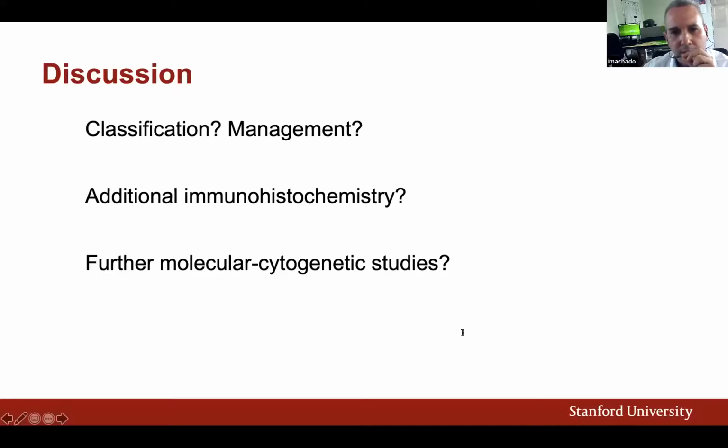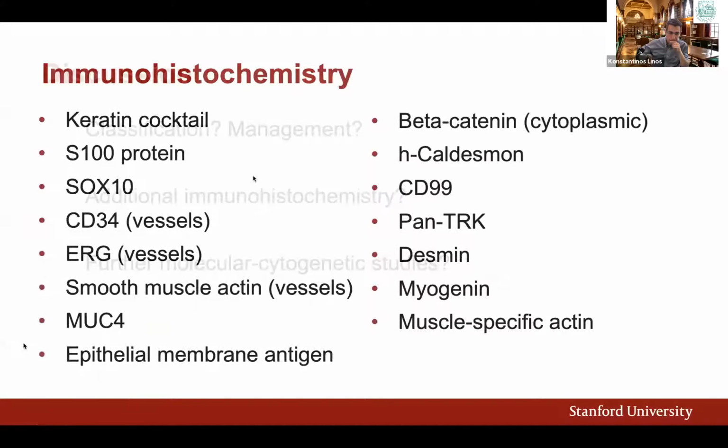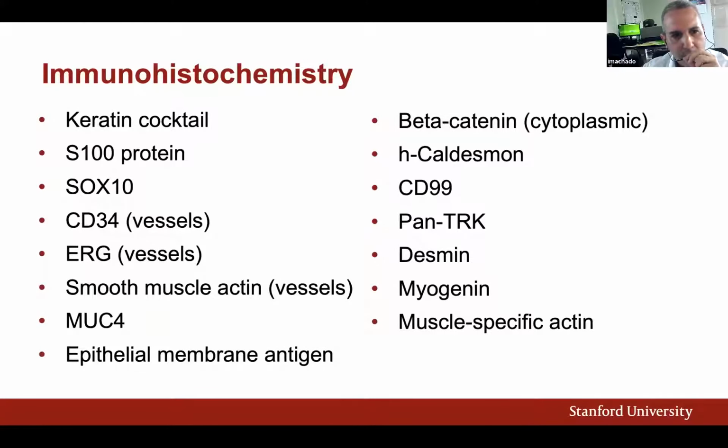So I have a question now for Dr. Grebs about this case. Everybody may have questions, either directly or by the chat box. Let me know, and you can ask directly by unmuting your phones. So, Dr. Grebs, I would like to know about the immunohistochemistry result of your case. I wonder about the NTRK immunohistochemistry. I don't know if you have shown it, but I'm curious about the NTRK immunohistochemistry result of this case.